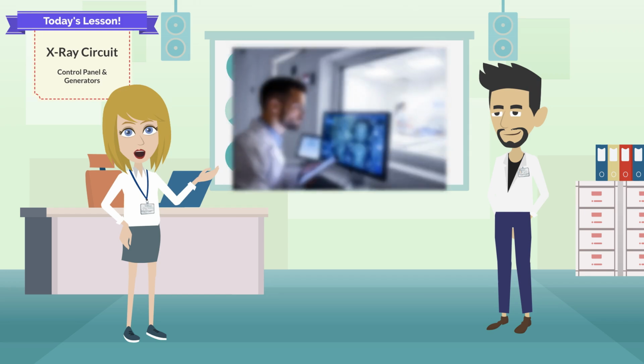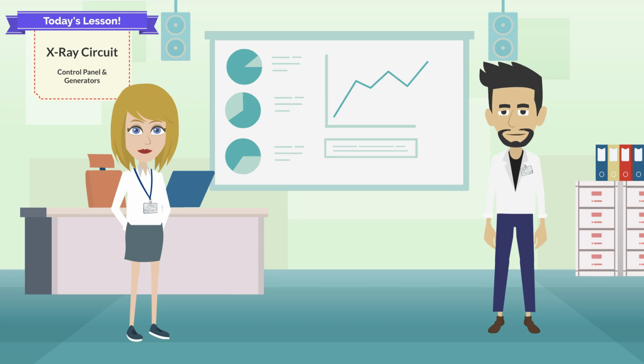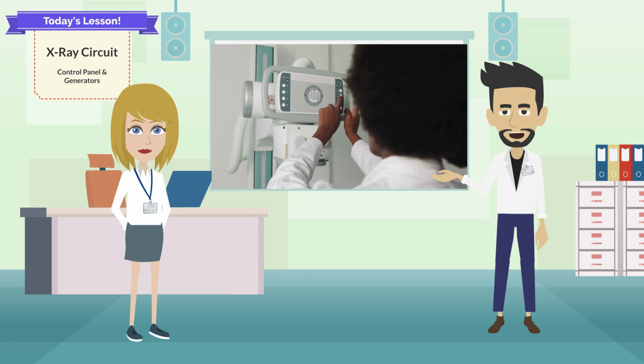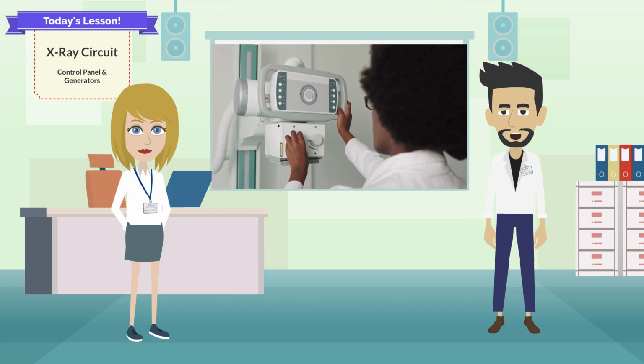It is not necessary to memorize the circuits in detail, but have a baseline understanding. The circuits help you to understand how three relatively complex electric circuits are integrated to produce X-rays. Because X-ray tubes may be damaged by improper use and are expensive to replace, we will go over guidelines for the safe operation of tubes and suggestions for prolonging tube life.